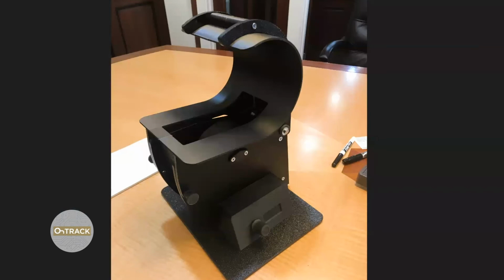But parts of it were 3D printed. Other parts of it were just sheet plastics that you can cut out very quickly on a router. And so the goal with this is, there's enough manpower and resources on this project that we can have a bunch of different designs geared for different manufacturing processes, so that we create options for who has to make these. Whether it's, I have a 3D printer, okay, use this design, or I have this basic machine shop, all right, well, this design is probably going to be easier. But this version had a mix of machine routed parts and 3D printed parts.